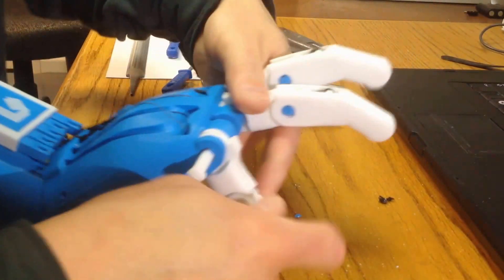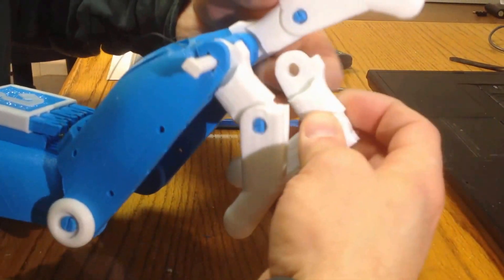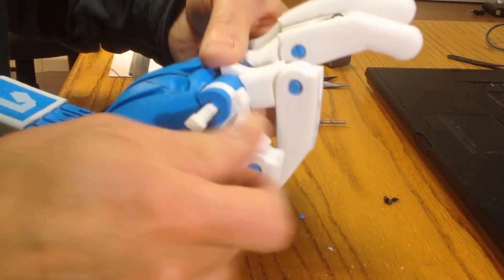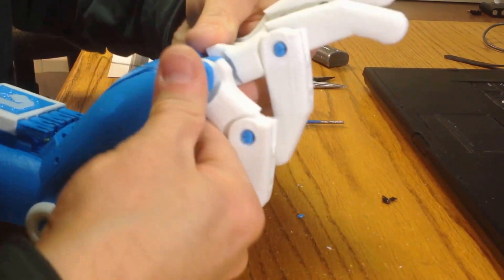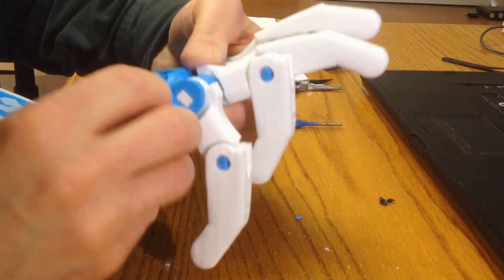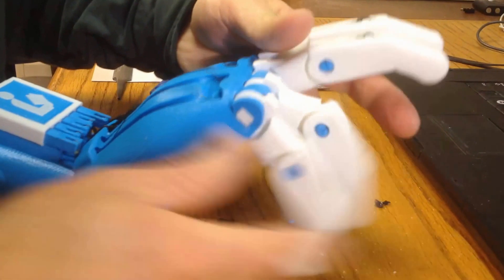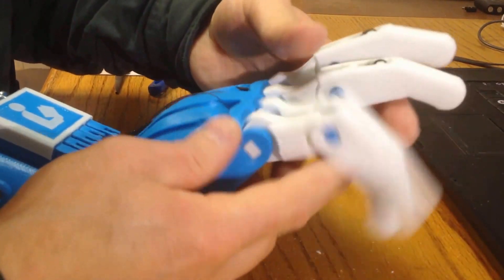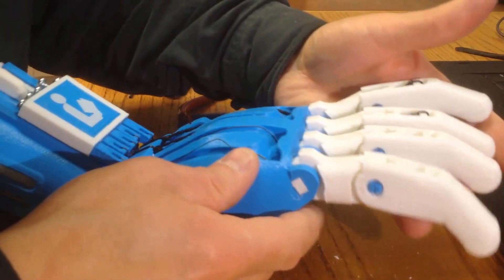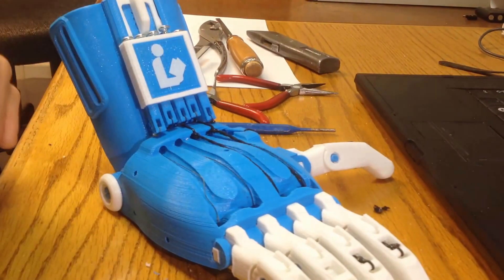That goes in. Then the next finger — it's time to put that in, making sure that these tendons don't get in the way and don't get trapped. I'm going to push that one in. That one's gone all the way in — no extra force needed this time. It seems to be free, but the proof of the pudding is going to be to put the elastic on and see whether or not it actually works once the elastic is on. That's the next step.